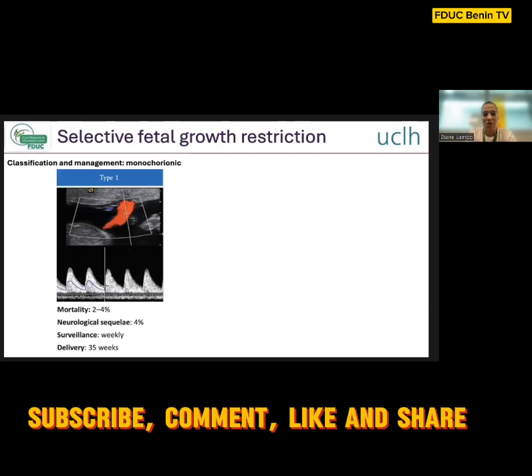What about monochorionic? So you spent a lot of time talking about dichorionic, but of course your monochorionic are perhaps a much more risky type of twin pregnancy. And basically the classification of selective growth restriction in your monochorionic pregnancies is dependent on the pattern of end diastolic flow in your umbilical artery. So in type 1, you can see that your umbilical artery has positive end diastolic flow. So the point at which you reach diastole is above the baseline.